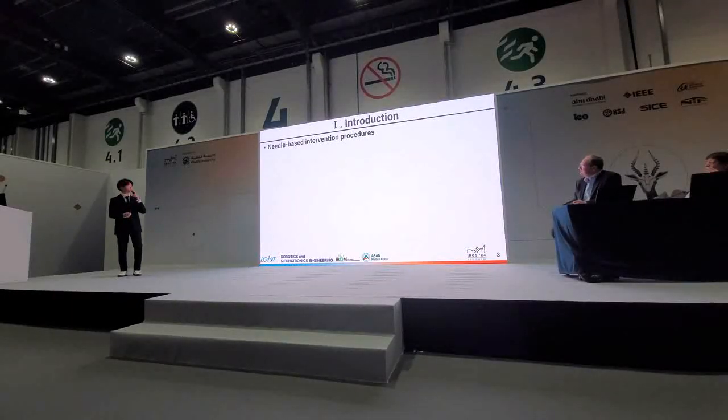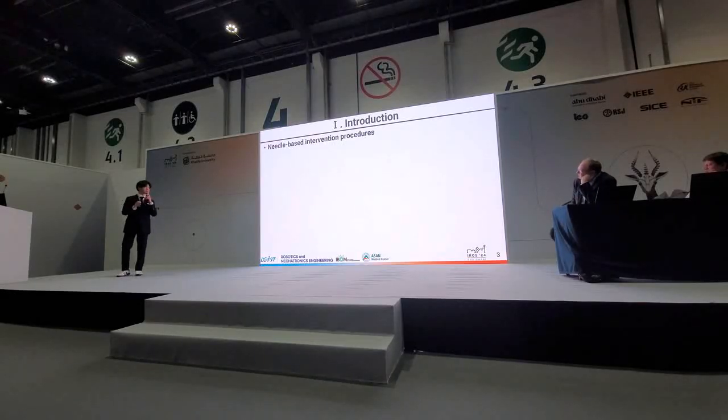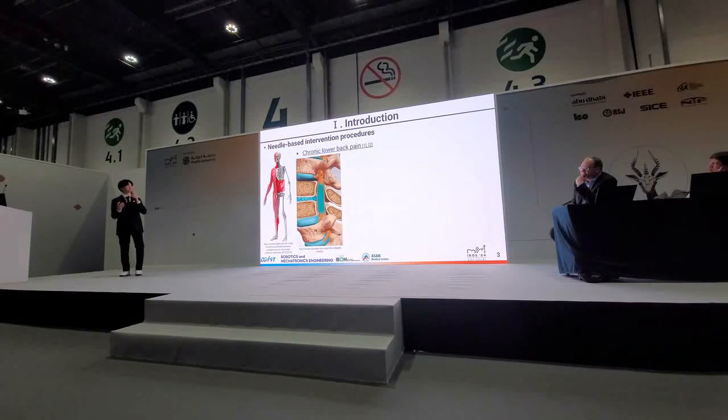My study is related to needle-based intervention procedures. The intervention procedure is a non-surgical treatment for a condition that otherwise requires a surgical treatment. This procedure involves accurately pushing a needle or surgical tool to the target location using a guide system. A representative example of an intervention procedure is the pain intervention procedure.